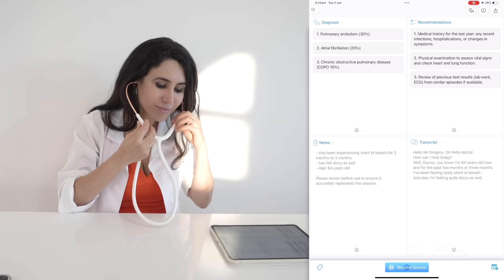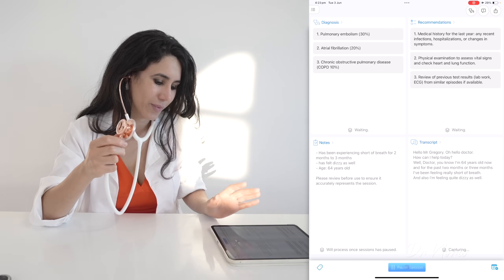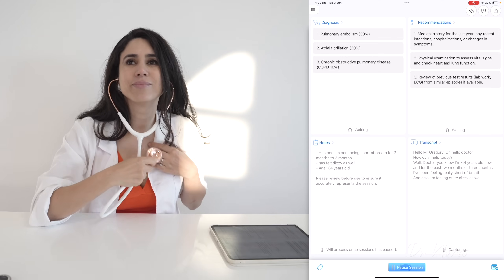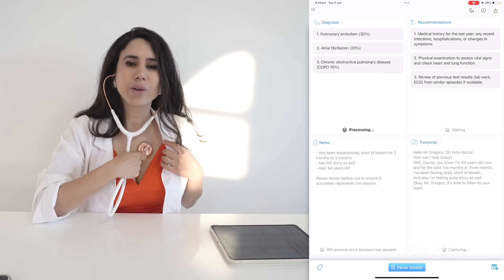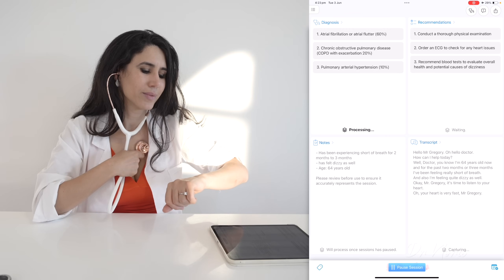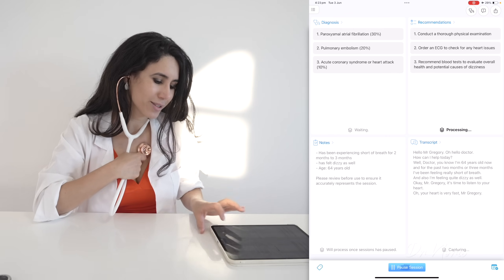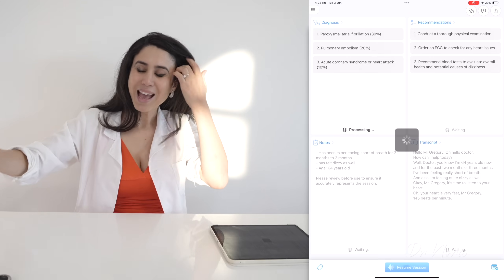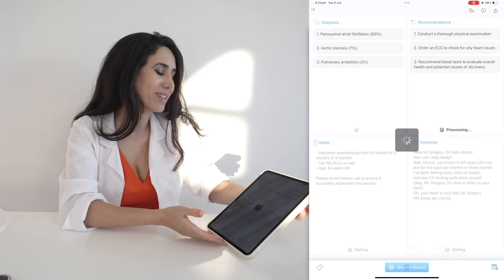Here we go. Got my stethoscope ready. Okay, Mr. Gregory, it's time to listen to your heart. Your heart is very fast, Mr. Gregory — it's 145 beats per minute. We're just going to pause it there and see what the artificial intelligence comes up with on this occasion.